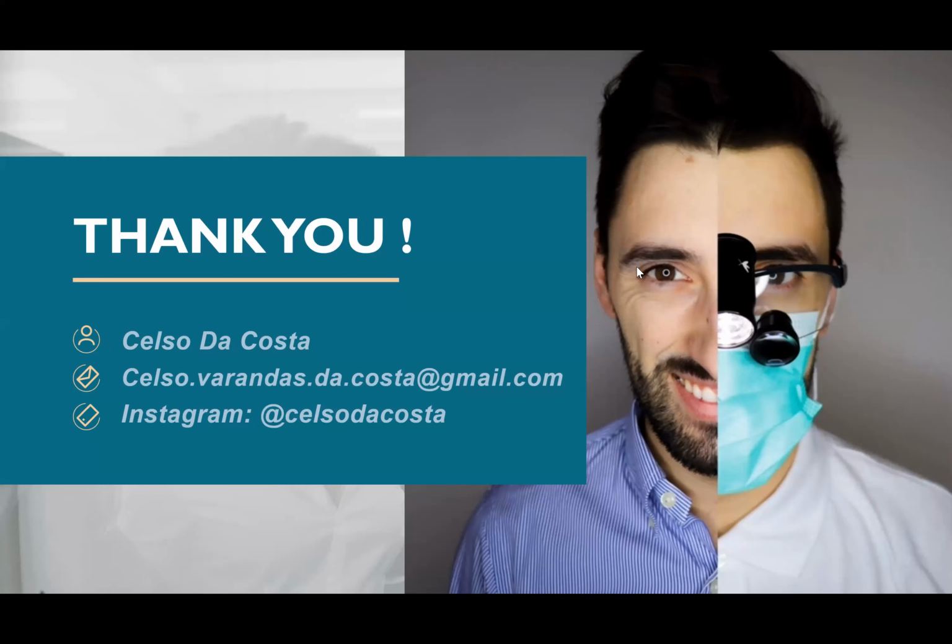One question from my side. In your experience, if you do CLICK before a home treatment, can you expect a shorter home treatment instead of the usual 2-week treatment? Yeah, that's the thing. With my patients, the home treatment lasts 1 week only, because we already start the whitening process with the CLICK. So we get 2 to 3 shades lighter. Then we go with the home kit, and instead of 2 weeks, we do 1 week.